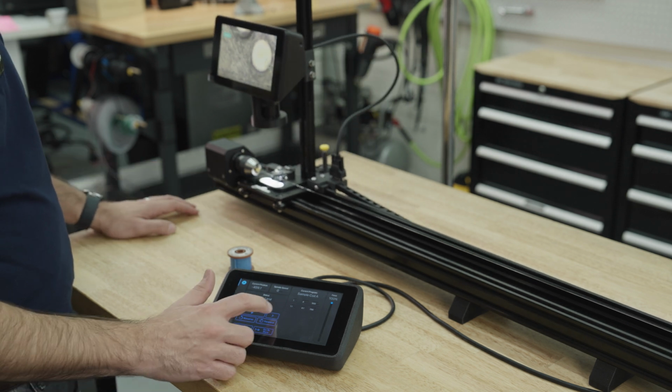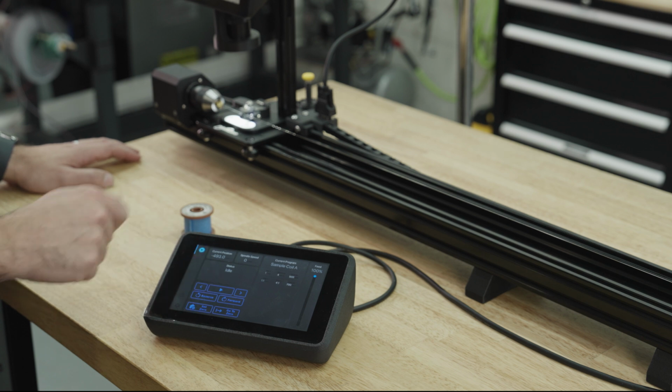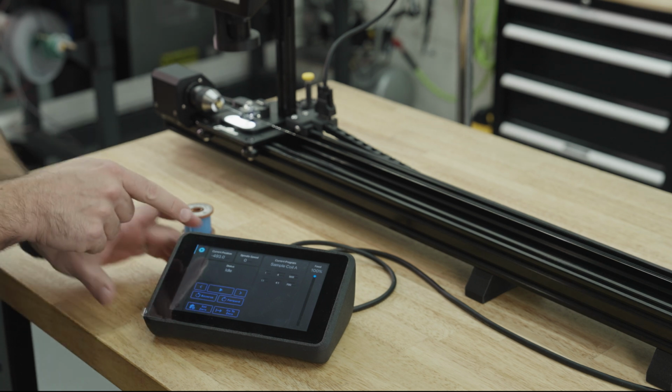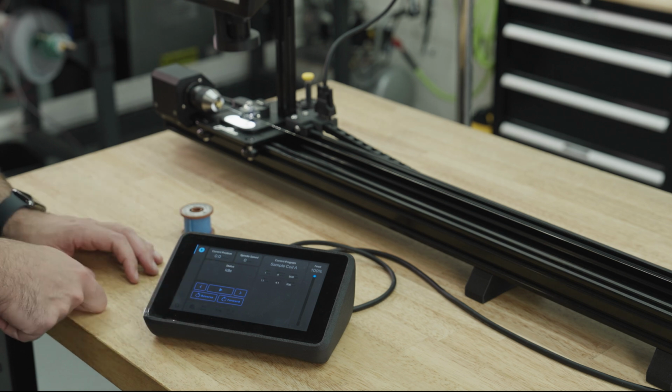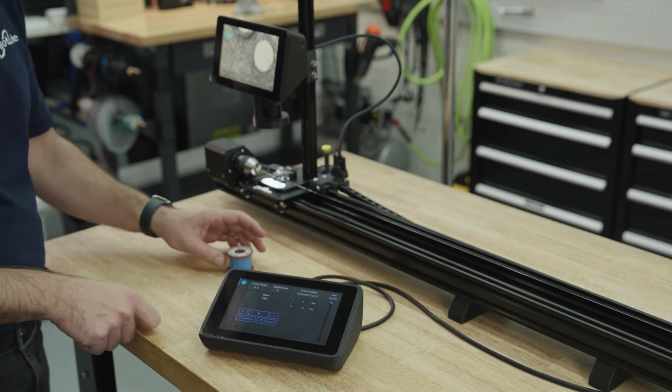If you hit the limit switch, no problem. Just back off until it's off. You'll see the current position says -493 here. We'll press set 0 to set that to our new 0 position.